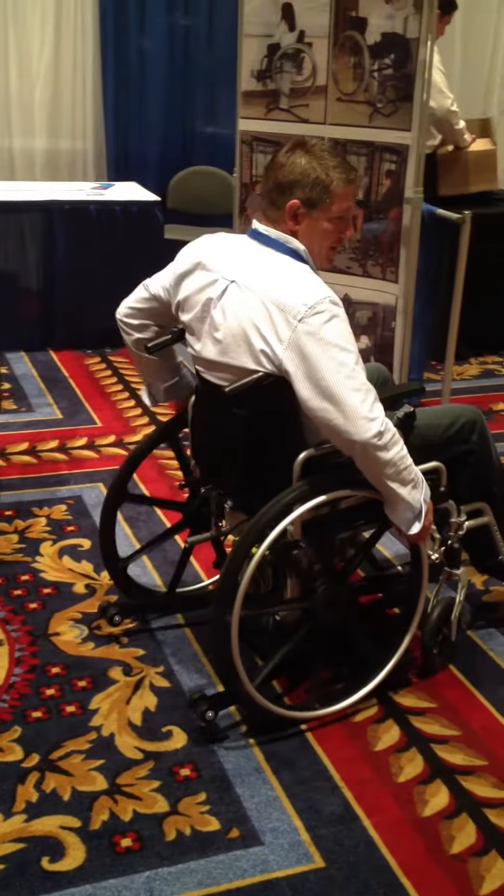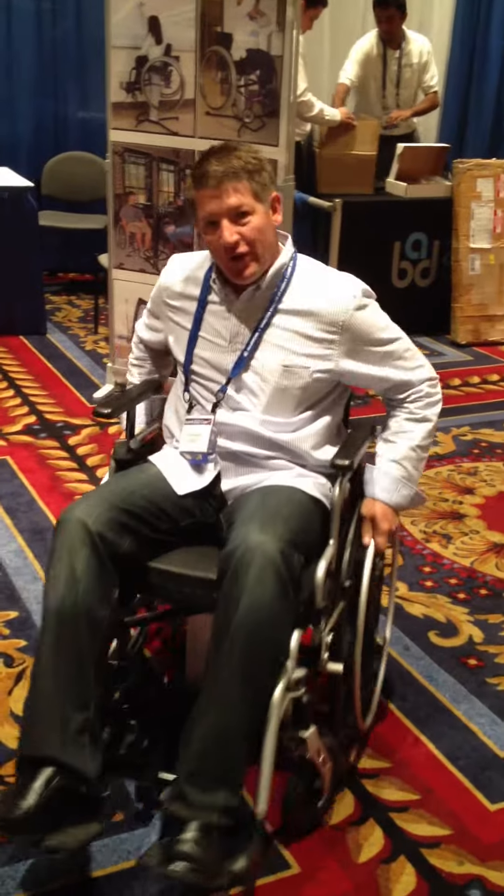Hi guys, this is the Katie's Lift. It's on this chair right here. It allows me to move around and go anywhere I want to go.